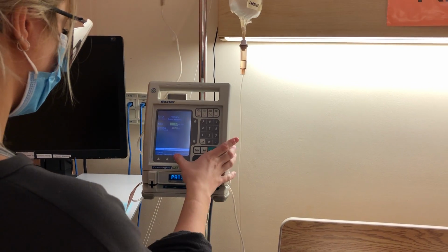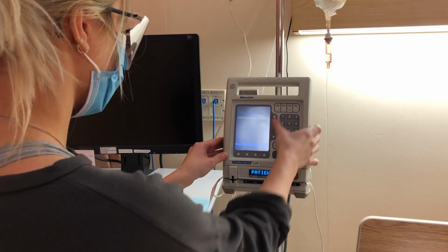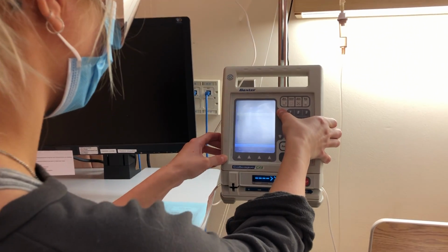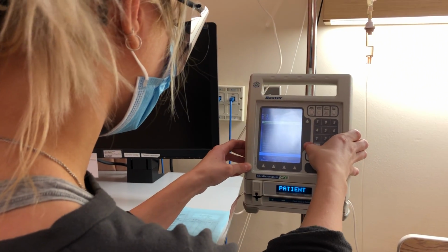Okay? So like I said, I'm inserting into the pump. I'm pressing on Guardian. Going down to insulin. Okay, good. So after 15 minutes, as I exit the room, I'm just going to be doing my own safety checks and making sure the bed is in position, and that we have a fresh environment.